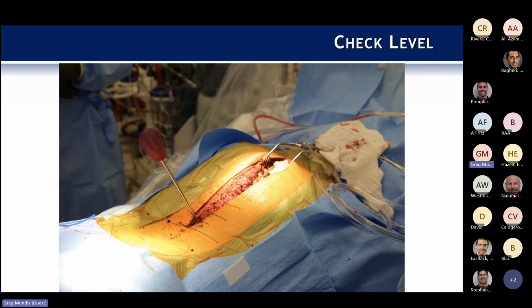So when we get to the operating room, we'll do just a typical exposure. Your goal here is to keep blood loss pretty low. A couple things about exposure that we do. One is we do hypotensive anesthesia. As long as we get a good baseline motor and things are okay, we'll quite classically keep the blood pressure pretty low. It means systolics usually in the 80s or 90s, and that'll keep the bleeding to a minimum.